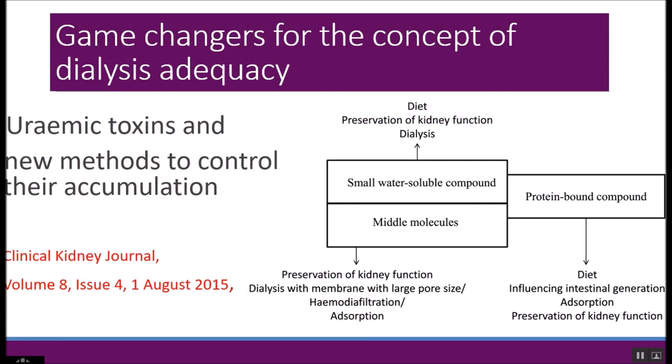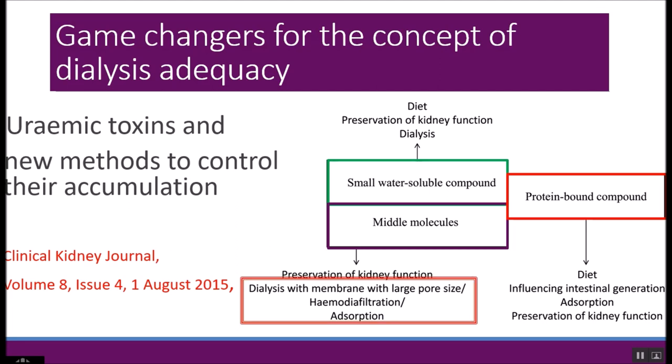Game changers for the concept of dialysis adequacy. Not only for small water-soluble compounds, going to middle molecules, you can probably remove more protein-bound toxins, with preservation of the kidney function. And with a membrane with larger pores, you can do hemodiafiltration, and improve the diet of your patients.